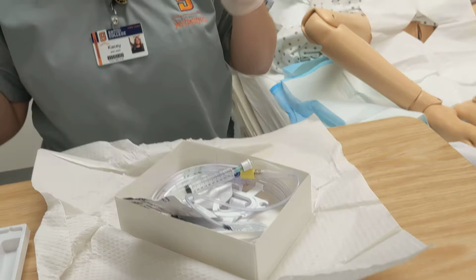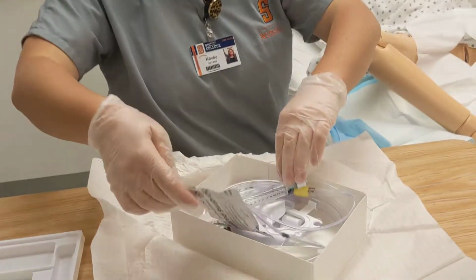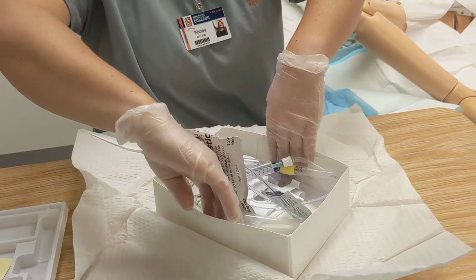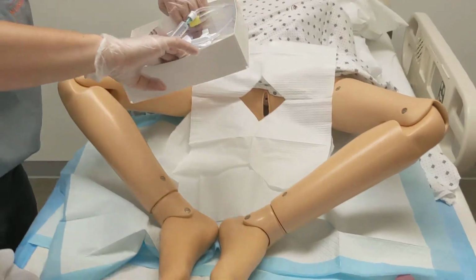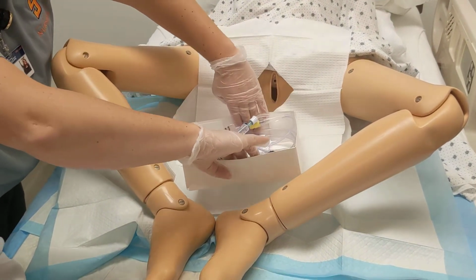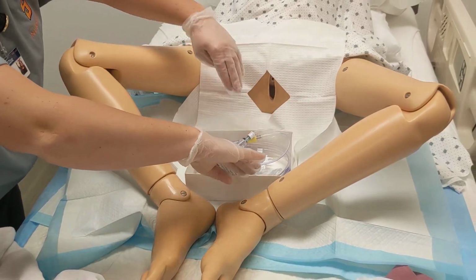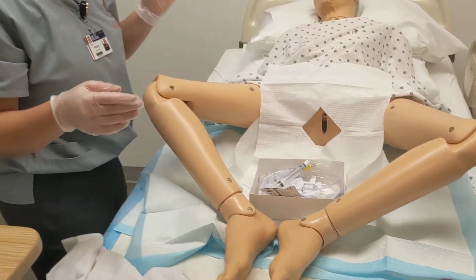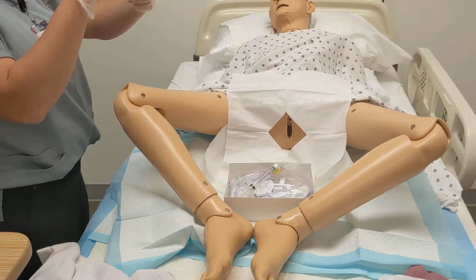All right, and now we are going to take this and put it between the patient's legs, ensuring that we're only touching the inside of this. Okay, and now we are going to use iodine to clean our patient.